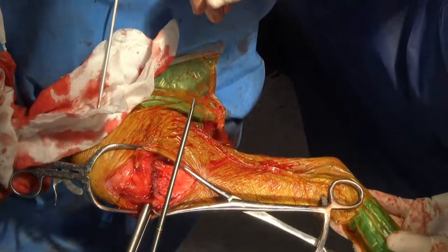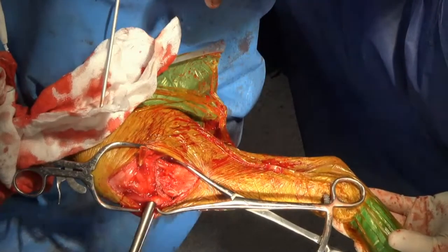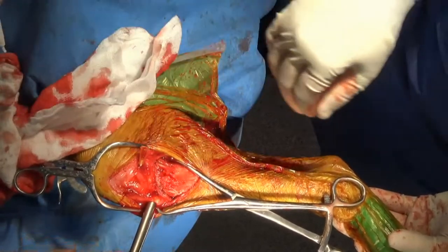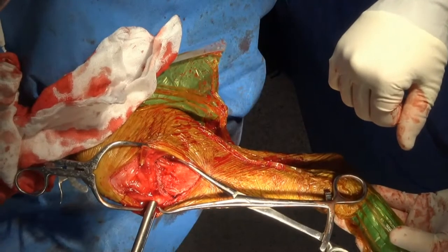So we take the back off that screwdriver. This screwdriver is again cannulated. So this is now going to drive the screw out of this kind of holder. So at the moment, everything's solid. We've got the compression against the osteotomy. That screw head is still engaged in this, what we call holder or driver.